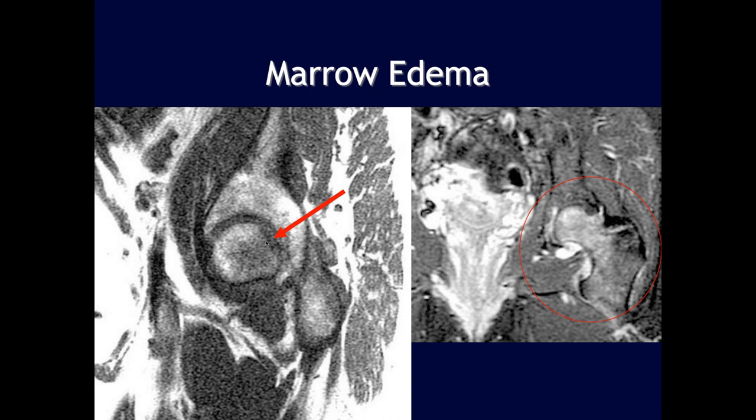an old case back in the early days of MR. And so instead of calling it osteoporosis, since we couldn't really see the density well by MR directly, we called it transient bone marrow edema syndrome. And in the old days, most people believed that transient osteoporosis was a form of avascular necrosis. It was thought that it was an ischemic lesion of the bone, and that's really why it hurt.